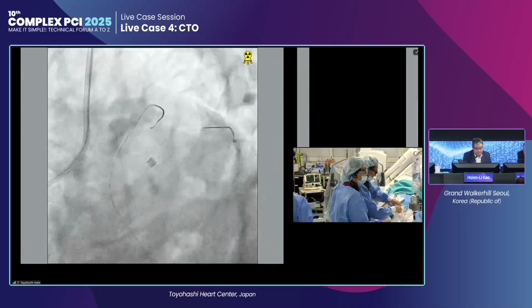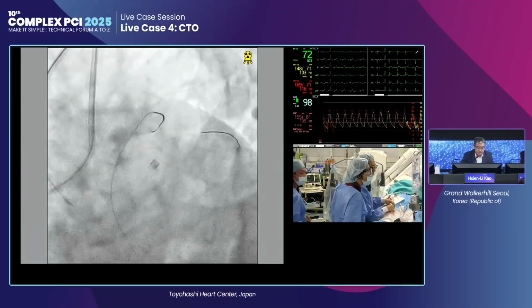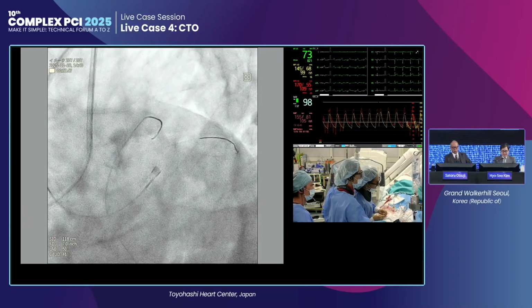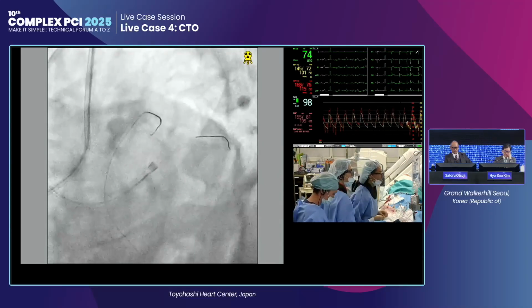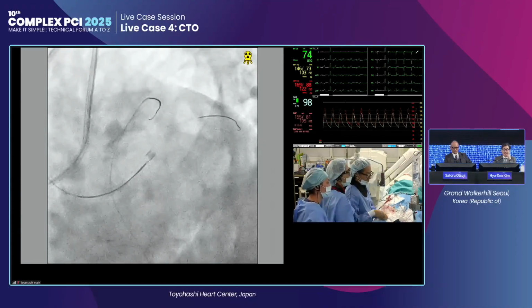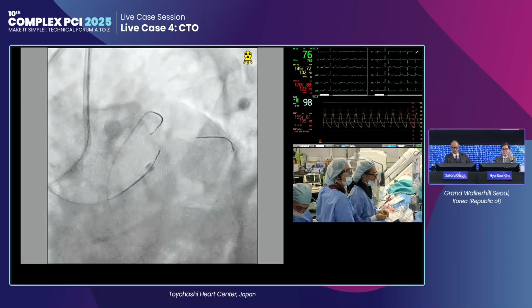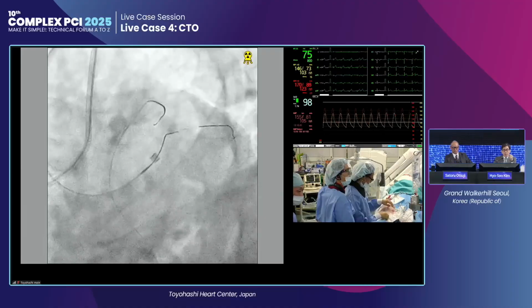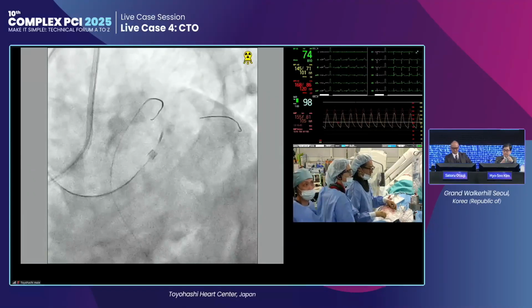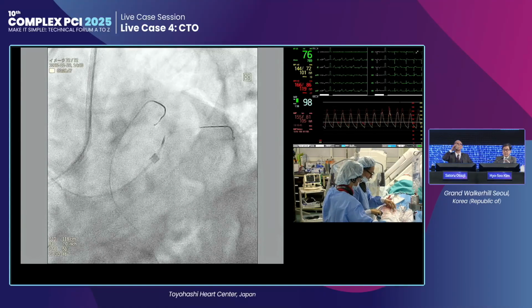Maybe yes, but at first there were so many septal channels. That's why we thought we could advance the guide wire more easily. So that is my mistake. Personally, I always feel it is more difficult to find the septal channel from the right side toward the left side because the origin is very complicated. In other words, the branching point from the PDA is very difficult to delineate.